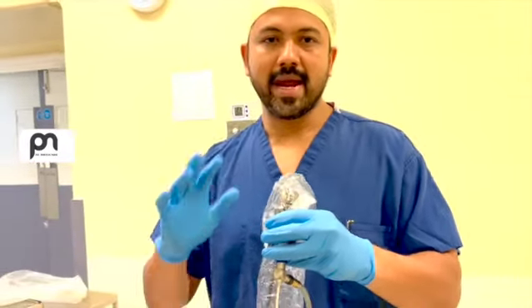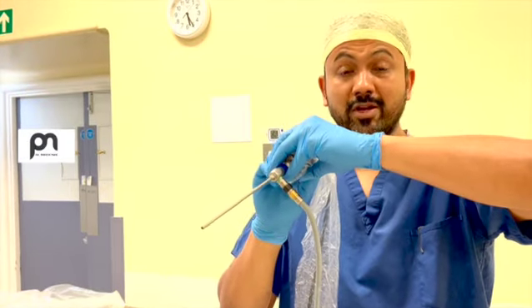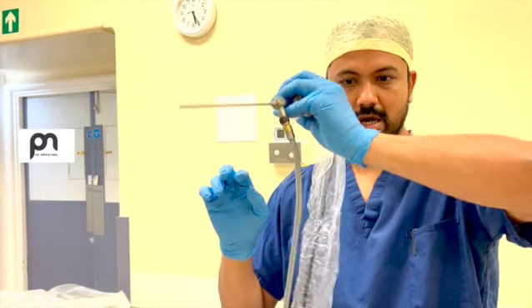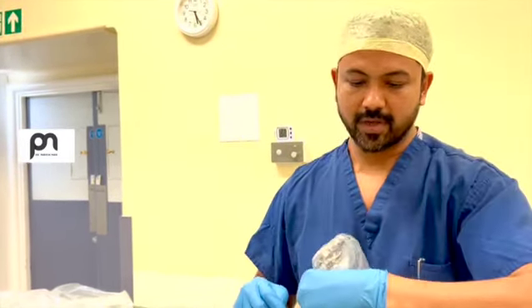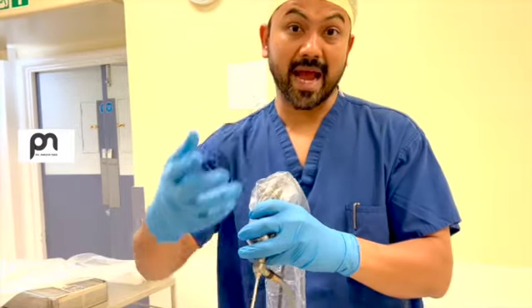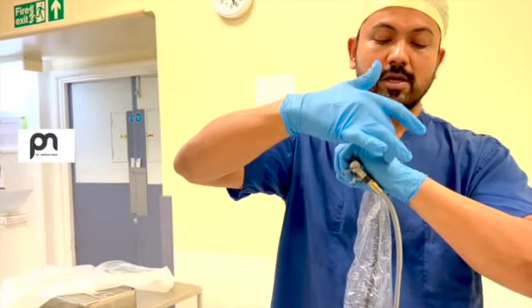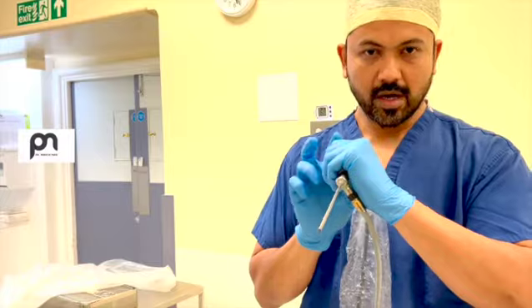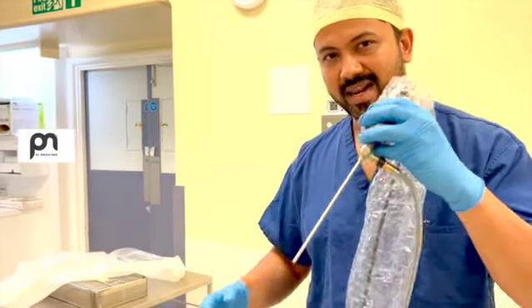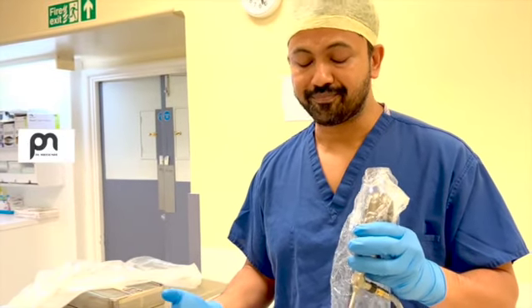Whatever way you are holding it, the main idea is to keep this joint in a neutral position. Keep it in neutral position. So when you're holding the camera and if your wrist joint is extended or flexed, it's a wrong position because it will start hurting. It will actually pain a lot. You may develop ganglion as well. If you're holding it too tight, like I'm stabbing someone, you start having cramps on this part. Now obviously all this method is for someone who is right-handed because it's the left hand where we are holding the scope. For someone who is left-handed or ambidextrous, it's quite easy for them.